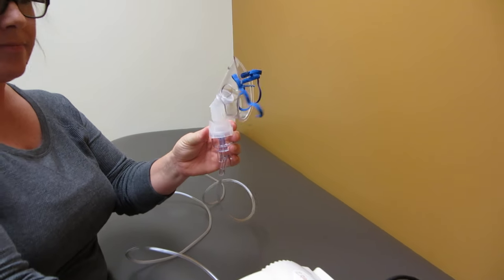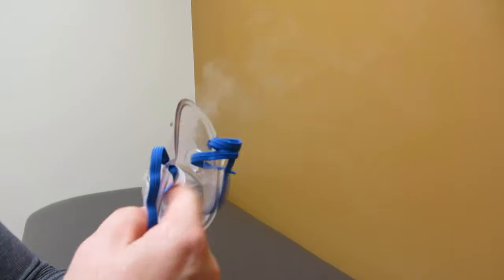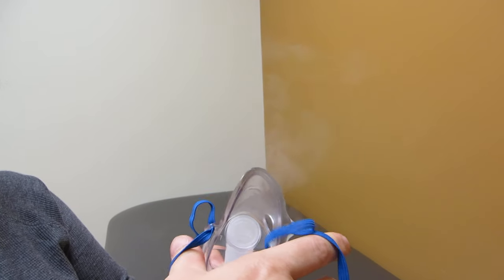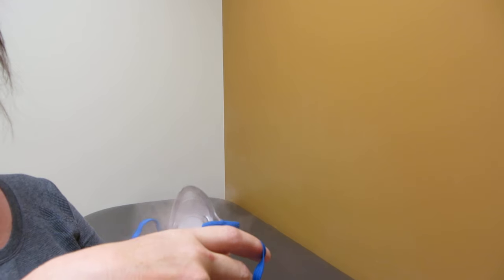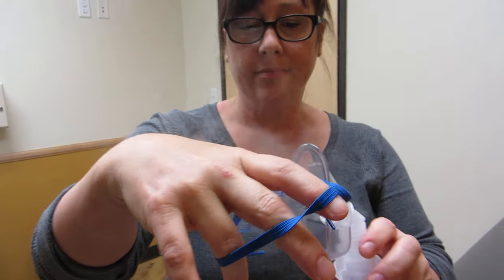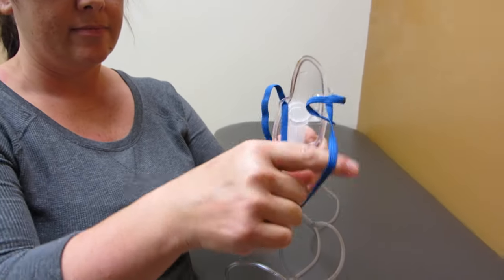And then she turns it on. And you can see that the nebulized air is now coming out of the mask, which we would presumably hold up to the patient's face. You can see how she would put the holder around the face. And that's pretty much it.